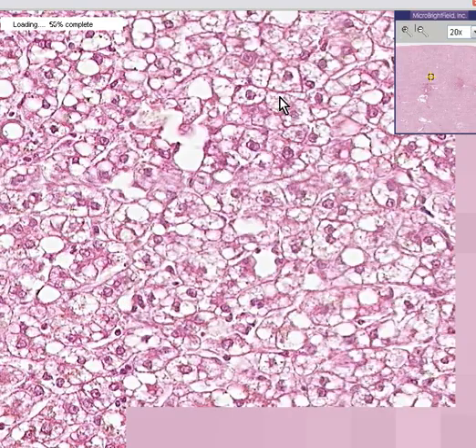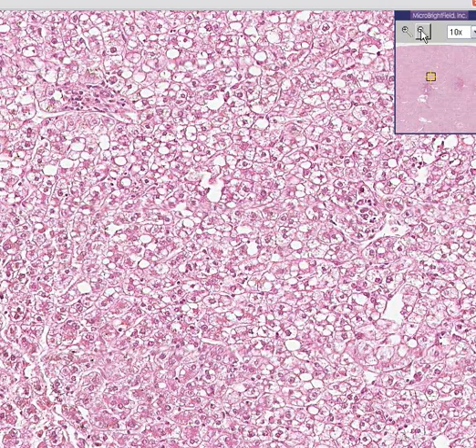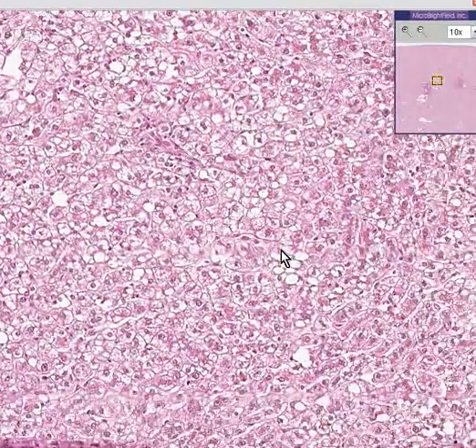quite huge. And I think we could say, although this is predominantly a microvesicular fatty liver, there are some big fatty globules out here which are much bigger than cells, and they're not completely within cells. Oh, here's some more out here as well.